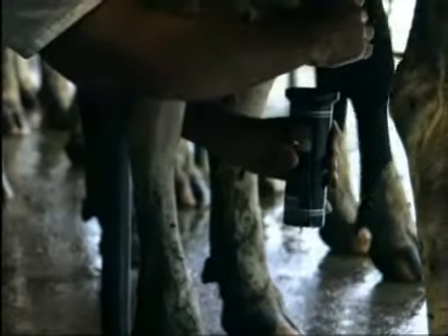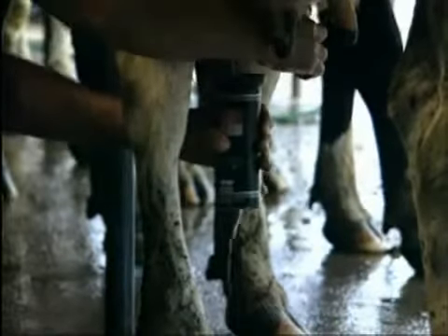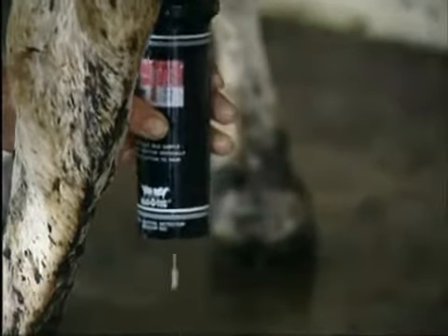For this instrument, there is no need to pull out from under the cow. No need to rinse out between samples or cows. Just keep on squirting and testing. No other device available can give you mastitis testing just as quickly or easily. No need for mental arithmetic remembering a series of decimal point numbers. Just a simple 0-9.